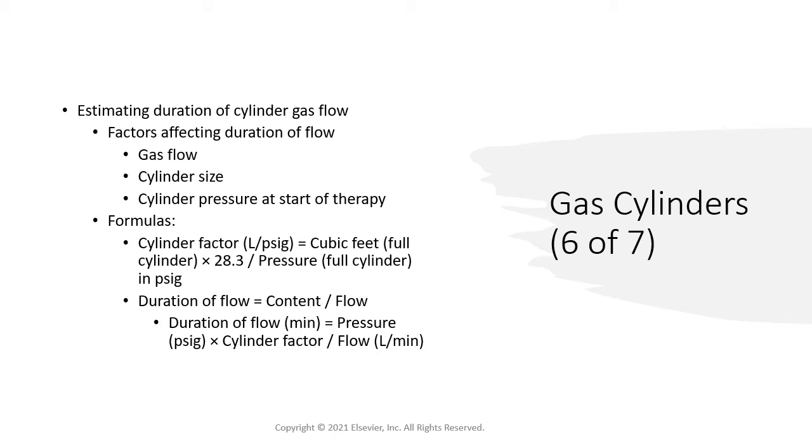You always need to allow for a margin of safety in estimating cylinder duration of flow. So we always round down.